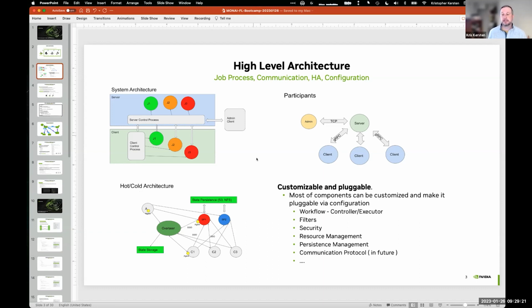The nice thing about FLARE is that at its core, it's a Python library, it's open source, and everything is spec-based so that it's customizable and pluggable pretty much from top to bottom, all the way from the low-level APIs that handle identity and communication up to the higher-level applications.